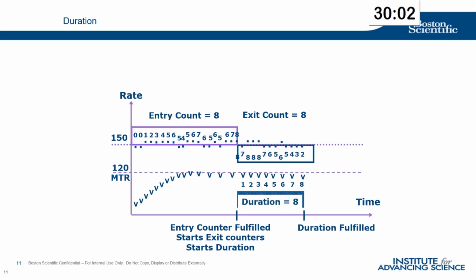For example, if the duration phase was 8 cycles of these events, then during these V events, which could be like 3 seconds or 2.5 seconds, depending on the V events, the pacemaker will also be monitoring the atrial channel, and it's going to see if all events are more than the detection rate. Then we will go to the fallback or the mode switch, which is the result of all this evaluation.